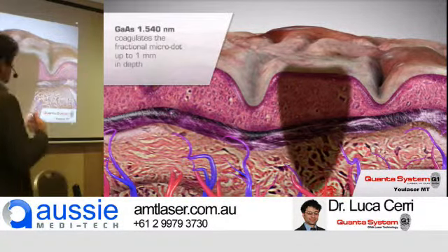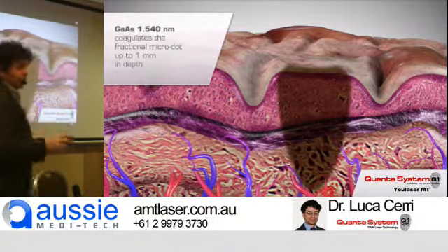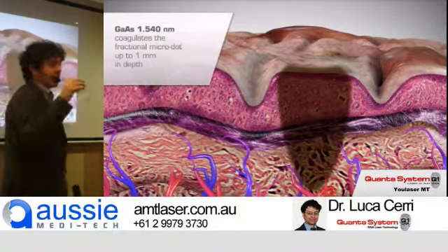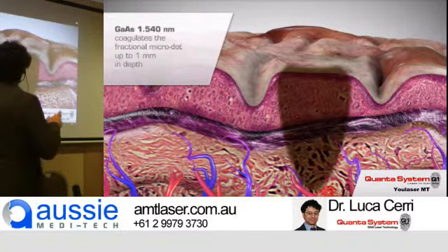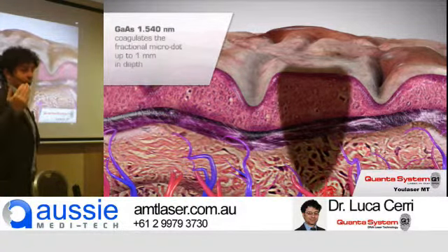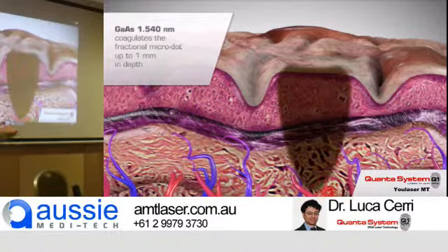How is this device really working? So two shots, or a single shot, where the 1540 is creating coagulation. Coagulation means that the skin there will go into necrosis. It's not immediately visible. The necrosis in this case is visible typically about an hour after the treatment. If we make a histology immediately after the laser shot, we cannot see anything.